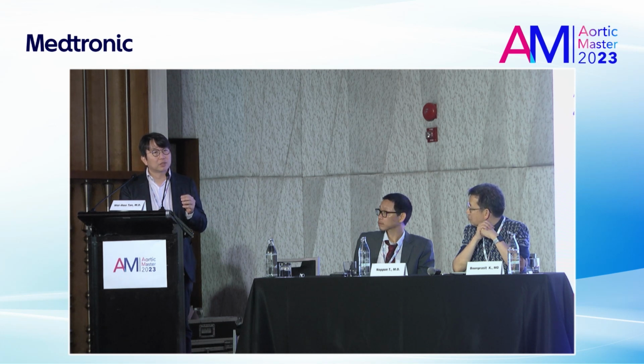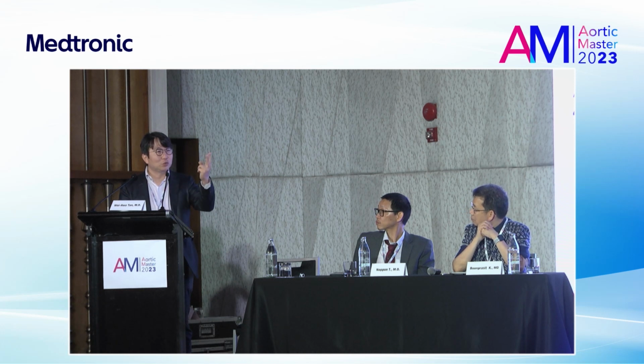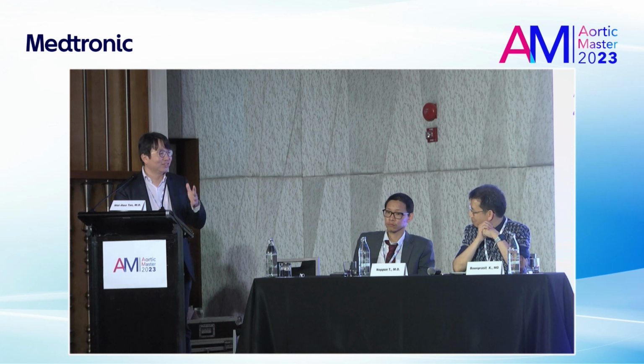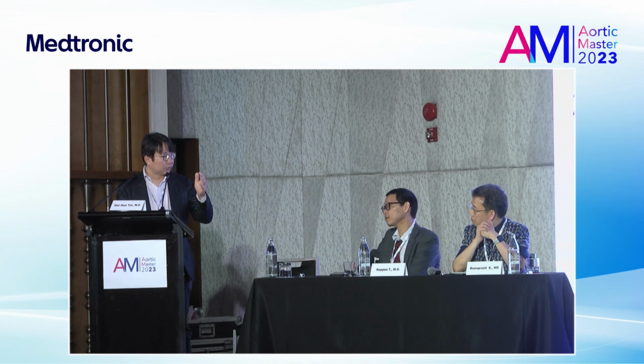And how to do the deployment of the coil actually is not difficult, because for me, I only try to occlude the outflow and the inflow. So there are only 2 parts you need to coil. I don't like to put all the coil in the false lumen, like throwing garbage into the false lumen. So I only try to occlude the inflow and also the outflow. I think these two parts are good enough.